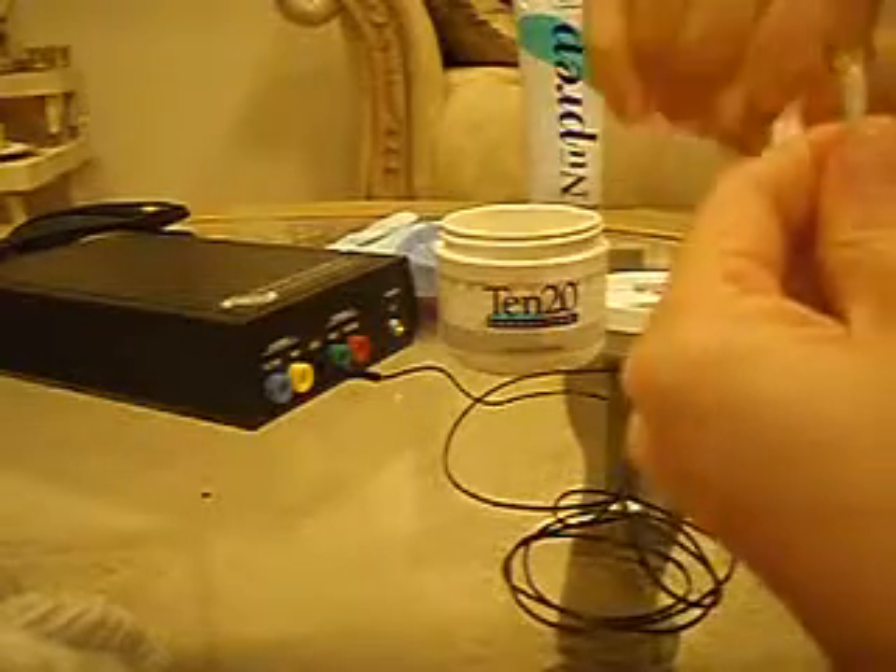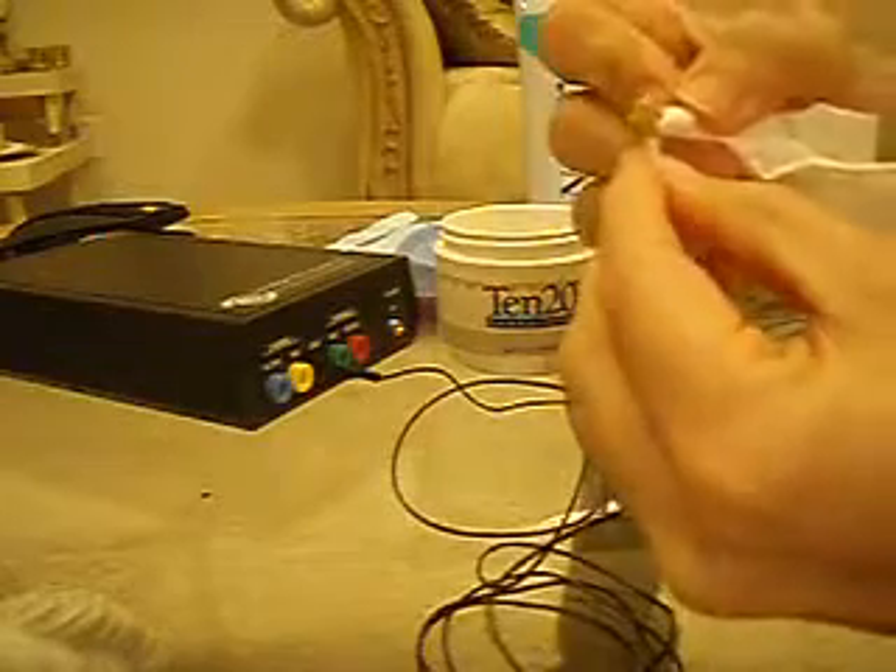To clean the electrode, you can either take a Q-tip, a tissue, or just warm water with ivory soap. One way is with a Q-tip — you can just remove the excess paste. If you have electrodes with a hole in the center, you may find that there's some paste in the center that's not coming out. If you'll take a Kleenex and just roll it up so it makes a point, you can use that point to stick through the hole and take out any of that excess paste.